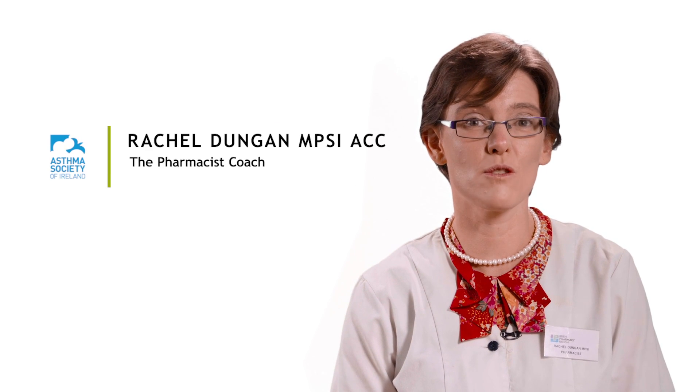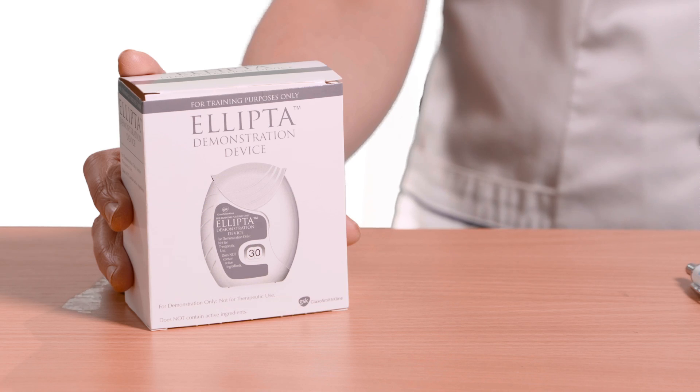Now I'm going to show you how to use the Ellipta device. This technique applies irrespective of the medication delivered in the device.